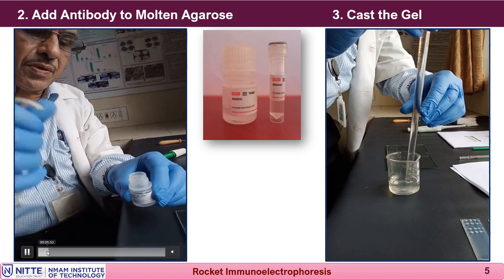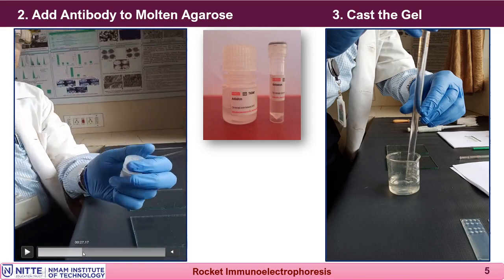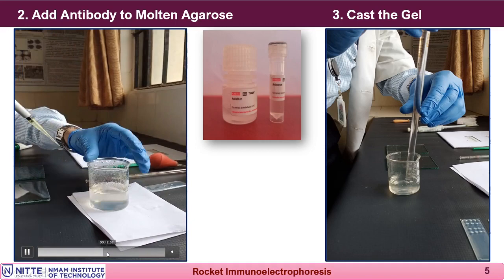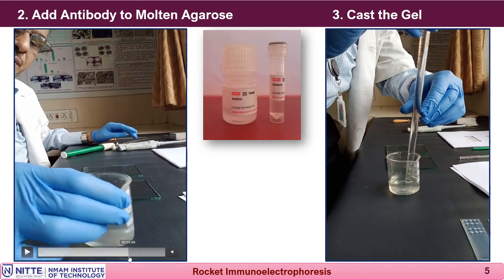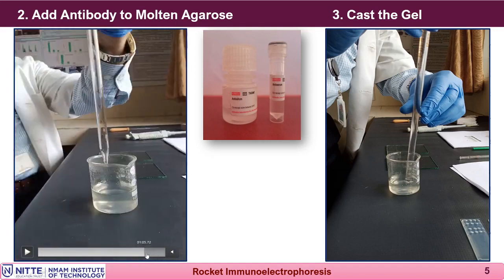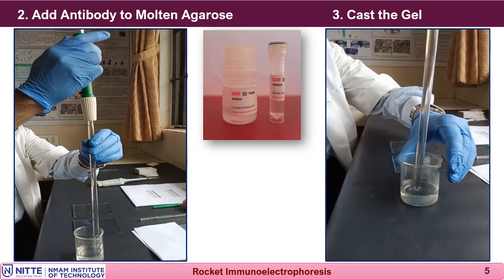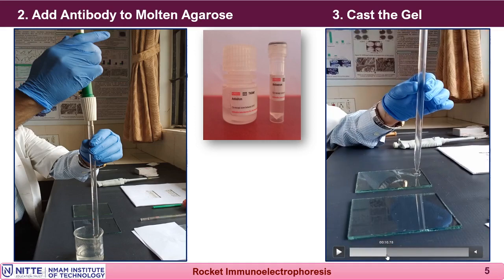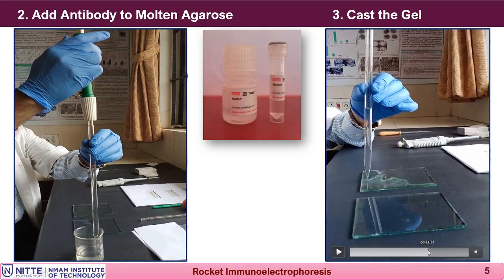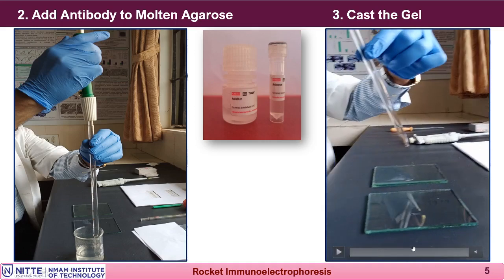A known concentration and known volume of antibody is added to the agarose. After adding the antibody, gently mix the agarose without creating air bubbles, then pour it onto the glass plate. Each glass plate requires about 15 ml of molten agarose. Once poured, allow the agarose to solidify at laboratory temperature.